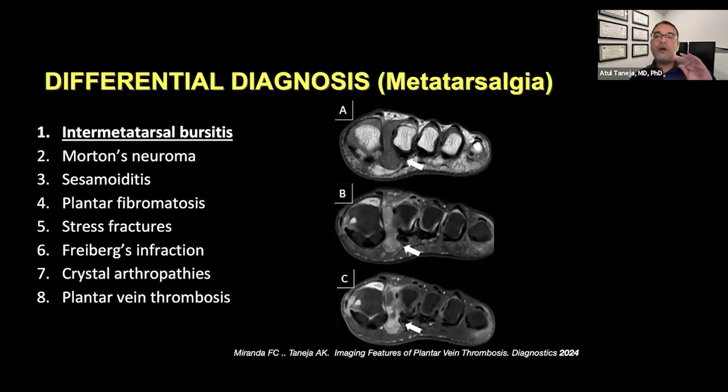All right. So we spoke about plantar plate injuries. I showed you the findings, both direct and indirect findings, and showed you some cases. Now let's try to exercise some differentials to keep in mind if you see something like this that may become in your request as a neuroma or a plantar plate, but you need to be careful.